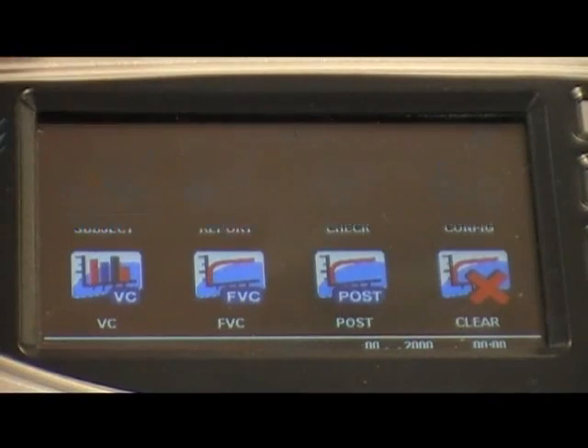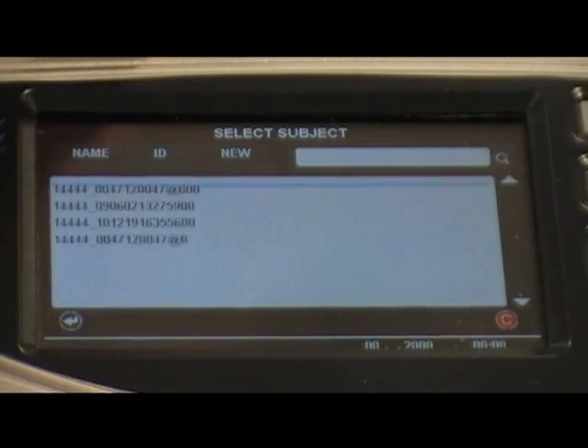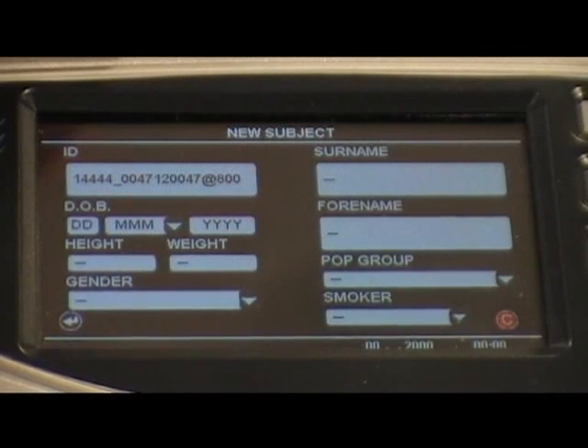Press the subject icon. This will display your stored subjects, allowing you to select either by name, by patient ID, or to create a new subject. If you are recalling a subject, the AlphaTouch will automatically store all subjects' test sections on the Spirotrack database and will update both the device and the database with any new subjects.